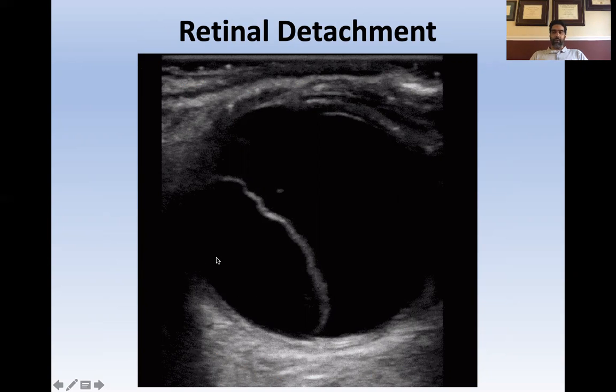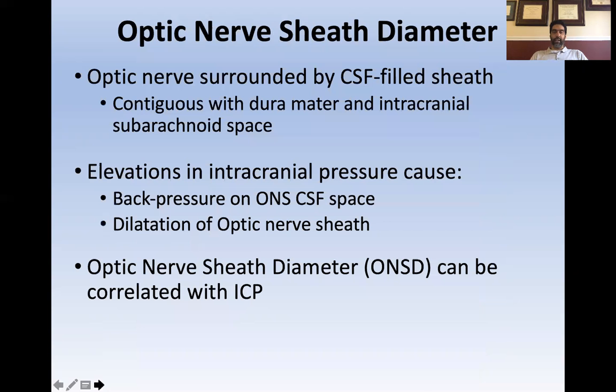I don't know how many of you are at all good at doing dilated exams using an ophthalmoscope. I'm not. So me diagnosing this by looking in the eyeball probably would be a no-go. But it's again very easily identifiable just using ultrasound. So as you can see, looking for even small, even subtle anatomic abnormalities in the eyeball is actually really easily approachable using ultrasound. Okay, so that's ultrasound in general, sort of acute emergency care.